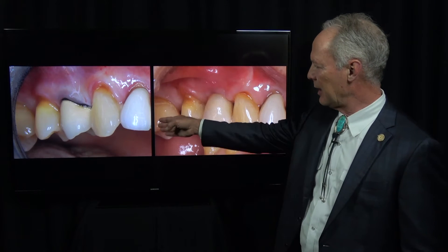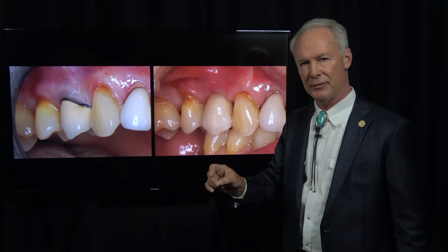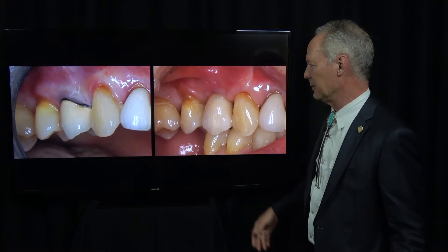Let's talk about extraction of a tooth that has a horizontal root fracture, bone grafting, and then placement of a root form implant, abutment, and crown. This is one implant case.